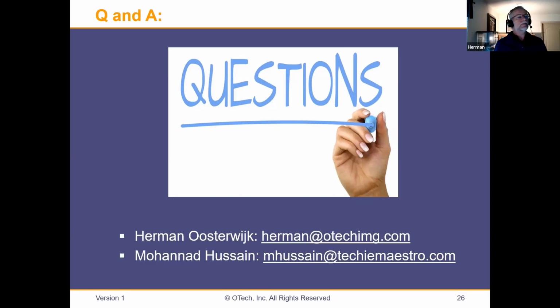The only benefit I could think of right now is that there's a lot of talk about zero trust from a cybersecurity perspective. You cannot trust anyone anymore. Even a service person coming on with a flash drive and trying to upload the latest and greatest software release, or download it from the internet to the CT scanner or the ultrasound, could be a virus.